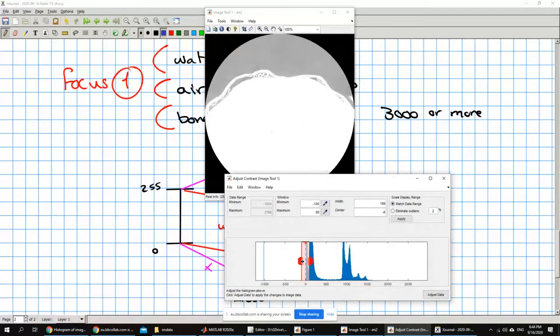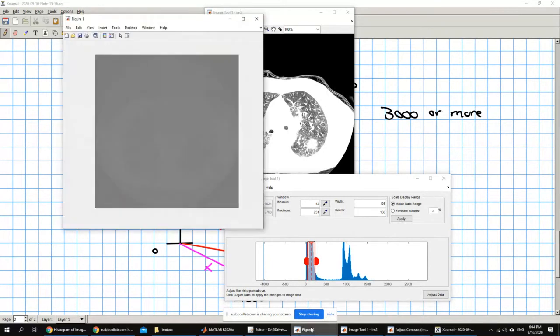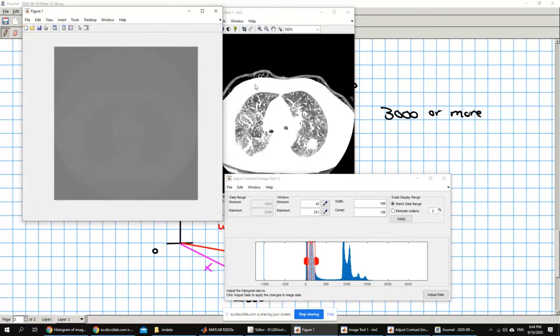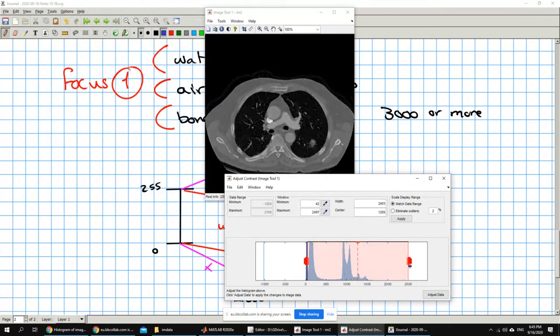It's just the whole image. If I move it a little bit, see now? If you look at the original image, basically, you don't see anything. You don't have any contrast. Here, you adjusted the contrast so that you see the parts inside the lungs in a much better way than what you would see if you increase it all the way up to have the whole intense image in the window. So here, this is the display that we have for this particular image.